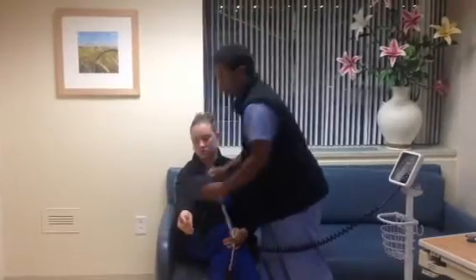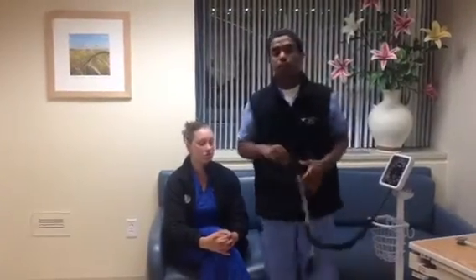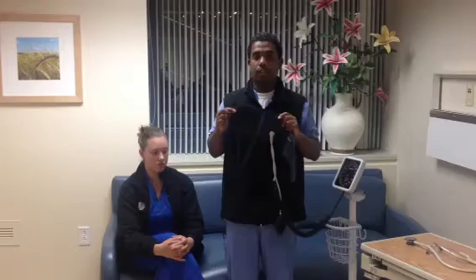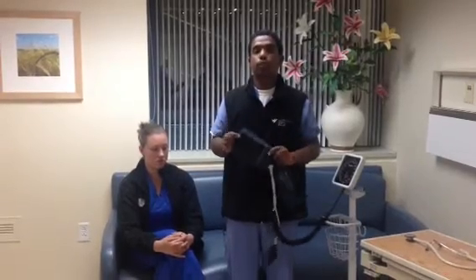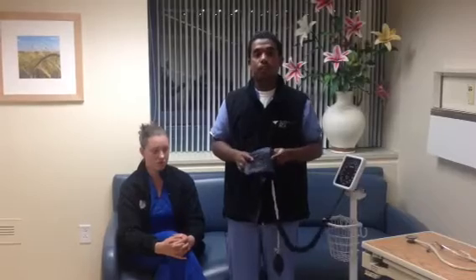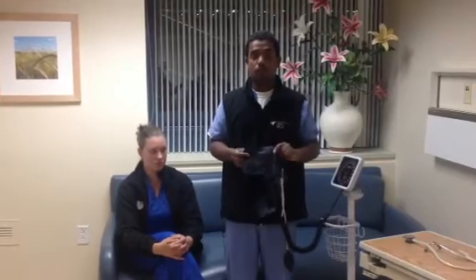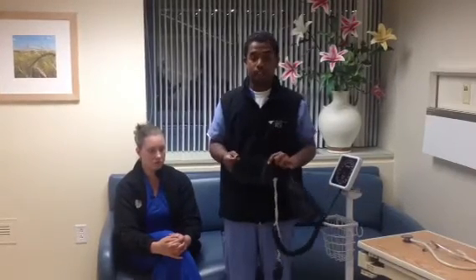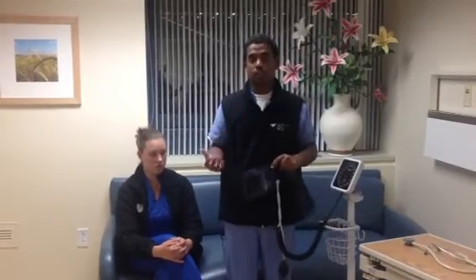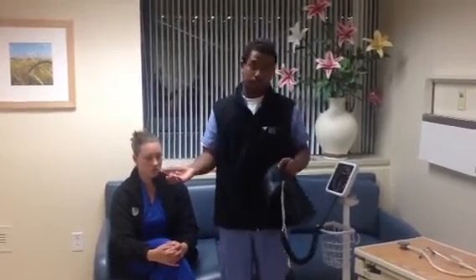It is very important to have the proper cuff for a patient because it will determine the blood pressure reading. If the cuff is too big, it will give you a false low reading. If the cuff is too small, it will give you a false high reading, which in return will affect any medications due for that patient based on blood pressure.